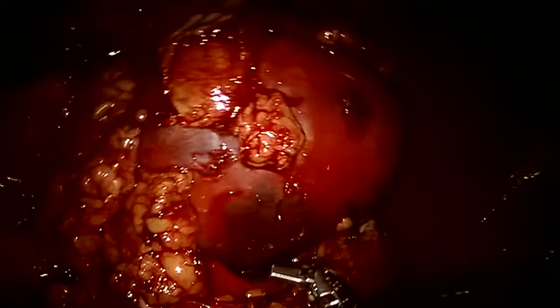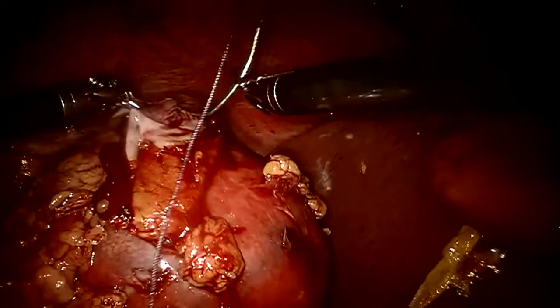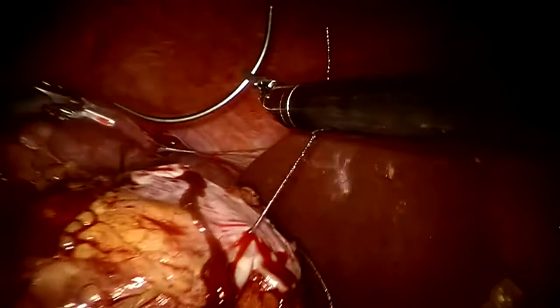Let's check this out. Okay, nephropexy stitch, please. This looks beautiful. This is just hematoma. We've beaten on the kidney, that's it. Nephropexy stitch: it is very important to put two nephropexy stitches, not one, two, to make sure there is no torquing of the kidney and thereby causing infarction. Just one stitch is not enough. It can torque around one stitch, so it has to be a two-point fixation.